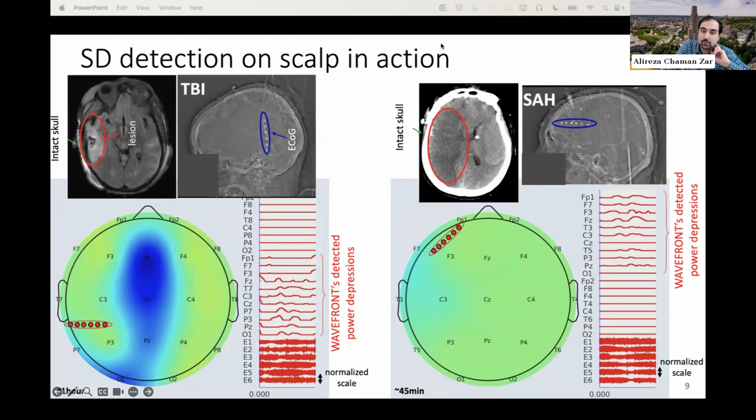Yeah, you're pointing to a very important, active research direction in the field, as well as active conversation with clinicians and collaborators. Since there is no automated SD detection technique that is clinically FDA approved, and it's not part of the standard of care, obviously there is no defined protocol about what doctors should do with this. But based on an increasing amount of clinical research data, multiple different techniques have been shown to be quite effective. One is, for example, ketamine. Ketamine has been shown to be very effective as an anesthetic to stop and prevent the propagation of SDs.